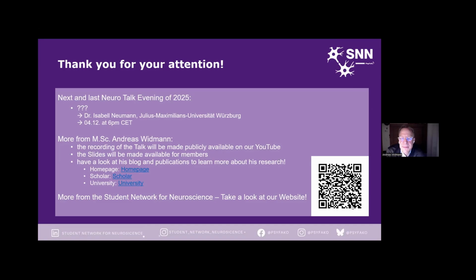What we regularly do is interpolate spatially when we have a dropout of an MEG sensor or EEG electrode. We can do that for a whole data set. Or, if we have a broken temporal piece in a long recording and additional information from surrounding sensors, we can interpolate that sensor only for a particular time. If we have any kind of information we can use for interpolation, that is helpful. Just drawing a line between 2 points is of course the least optimal solution, and you have to be aware of possible side effects. But if there is no more supporting information, then you are at the point where you are.